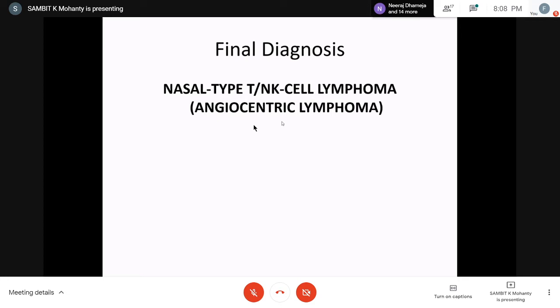Yes. What is the state of CD30 and any cytotoxic markers, TIA, granzyme? Yeah, I'll show you that picture. The CD30 was negative. Okay, so just to rule out ALCL, as these can be confusing, or a CD30 positive lymphoproliferative neoplasm. You mean to say the lymphomatoid spectrum? Yeah, and I'll show you that. In this case, I'm sorry, I did not have the picture of TIA and granzyme B. I think TIA was positive, and granzyme B I have to check and get back to you. These are old slides, but TIA was definitely positive.